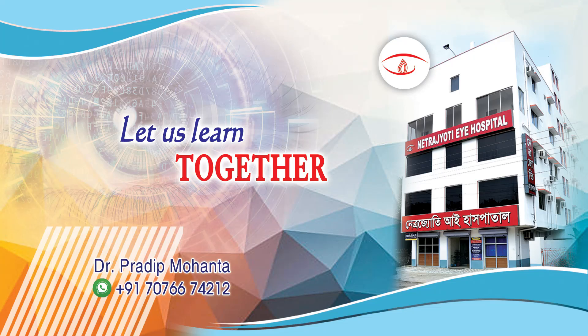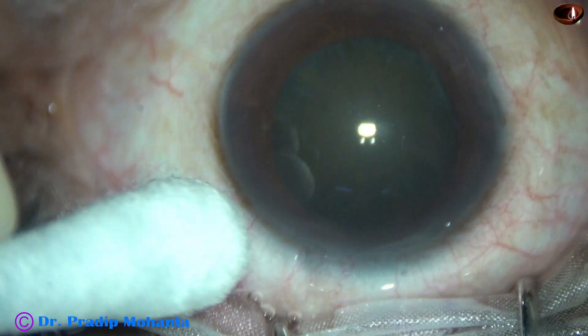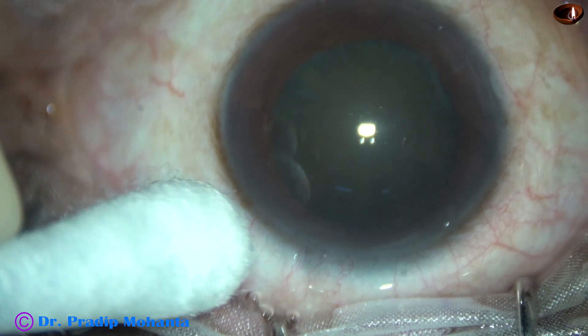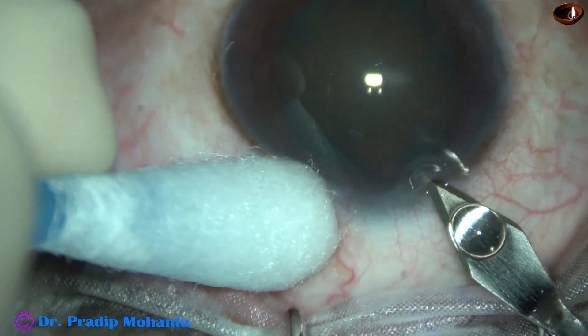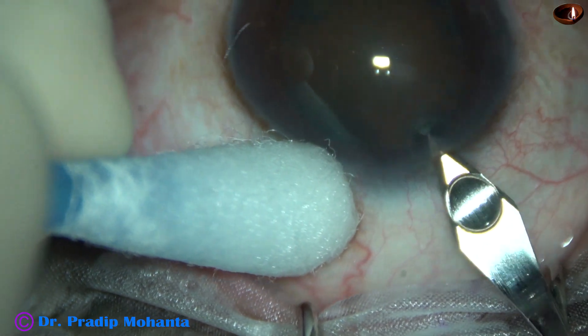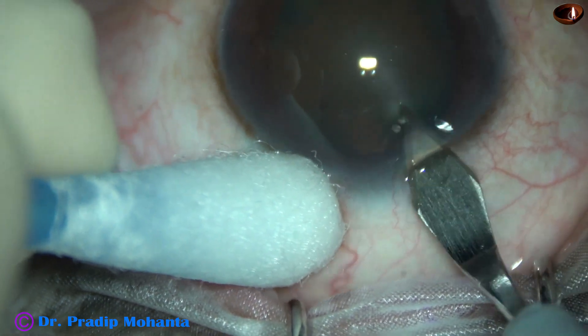Friends, welcome to my workplace at Ranakha, West Bengal, India. This is a soft cataract. The surgery is being done under topical anesthesia. The ocular surface has been anesthetized by proparacaine eye drop.